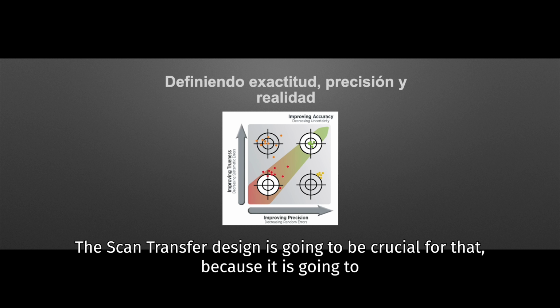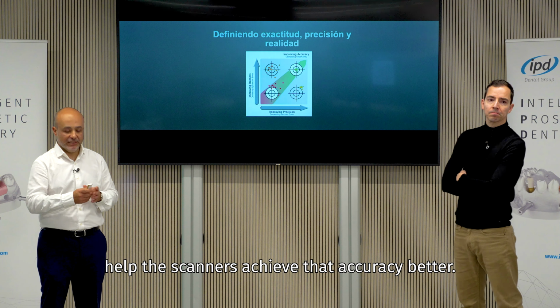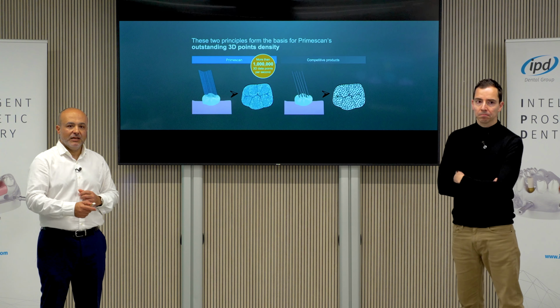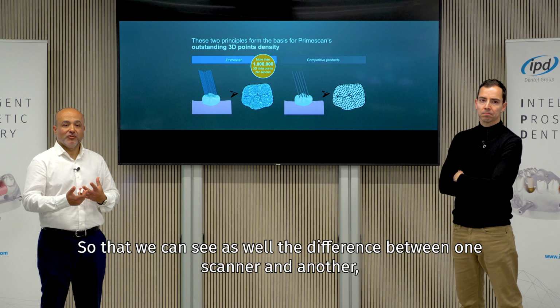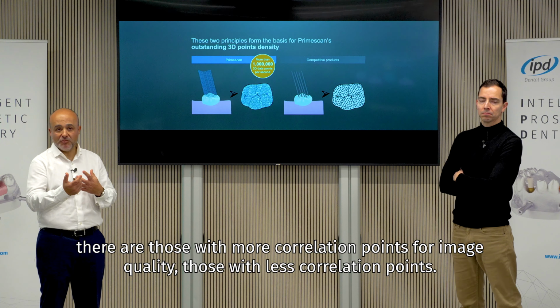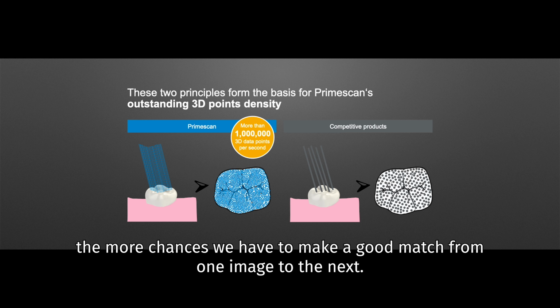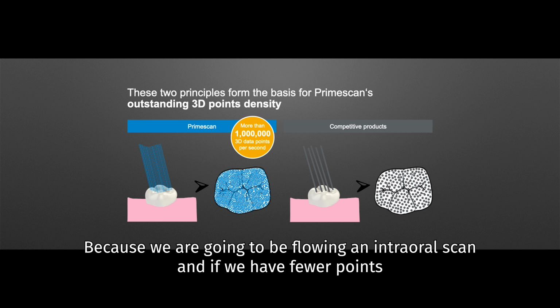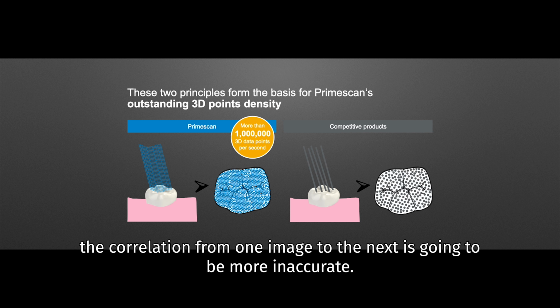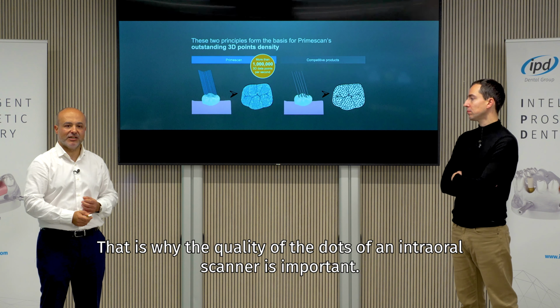The scan transfer design is going to be crucial for that, because it is going to help the scanners achieve that accuracy better. So that we can see as well the difference between one scanner and another. There are those with more correlation points for image quality, those with fewer. And the key is that the more correlation points there are, the more chances we have to make a good match from one image to the next. Because we are going to be flowing an intraoral scan, and if we have fewer points, the correlation from one image to the next is going to be more inaccurate. That is why the quality of the dots of an intraoral scanner is important.